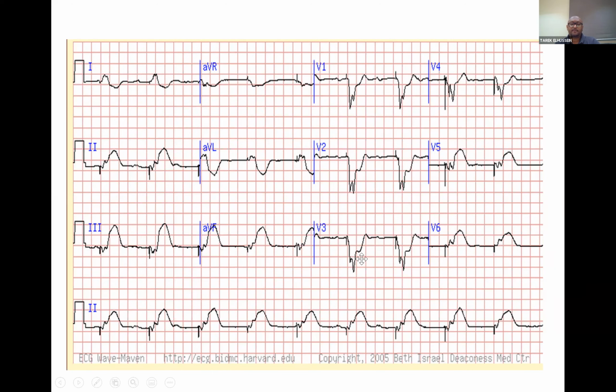Doctor Tarek, in V1 the PR is different. In V1, the first pacing spike comes at a different delay. Usually the setting for the ventricle, once it senses the atria, is set to a limit to start the pacing. So as long as the pacemaker is pacing at a normal rhythm, at a normal rate, most likely there is no problem with it. This variation can happen normally.